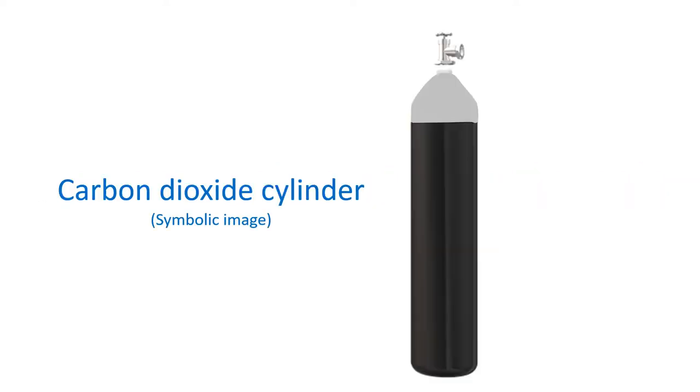Hence the role of carbon dioxide angiography in those with kidney failure, as carbon dioxide is devoid of any such toxicity. As carbon dioxide is highly soluble in blood and rapidly cleared from blood, it is ideally suited as a negative contrast agent in those with kidney failure. But the technique of carbon dioxide angiography is a little more cumbersome than contrast angiography. We need a medical grade carbon dioxide cylinder, 3-way stopcocks, connected tubings, syringes, and a reservoir bag for interim storage of carbon dioxide.